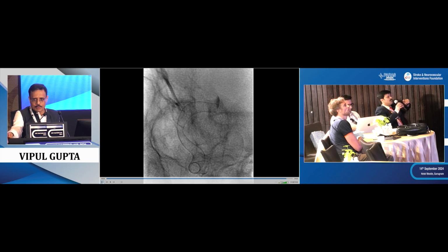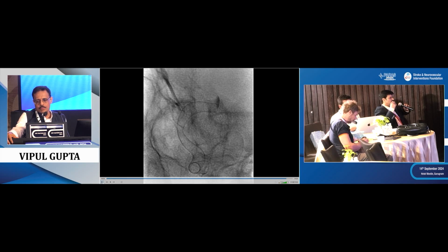Yeah, Ajay. So, Vipul, the proximal end, what I feel in many cases with us also, while we try to bump the proximal end when it is not opening, many a time the proximal struts tilted or moved inward.